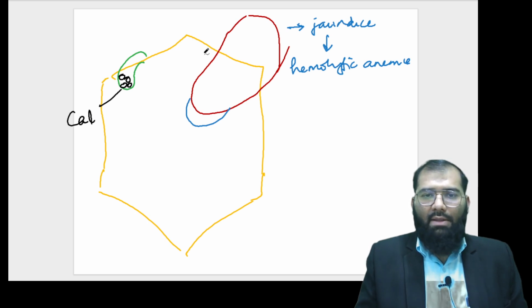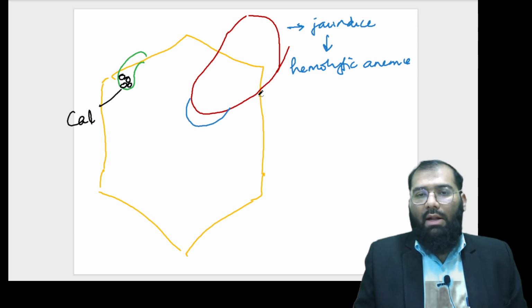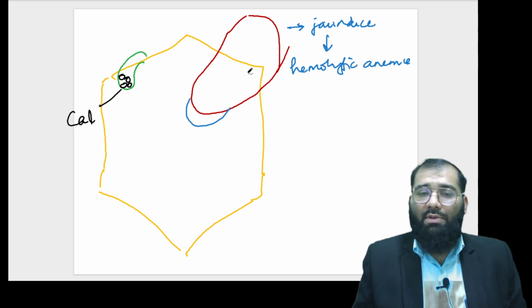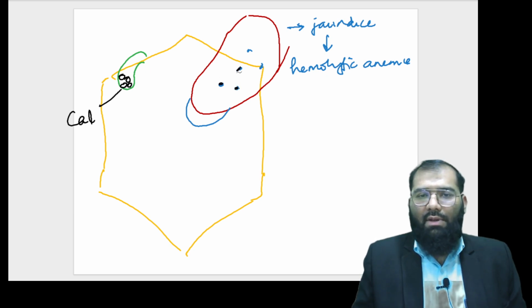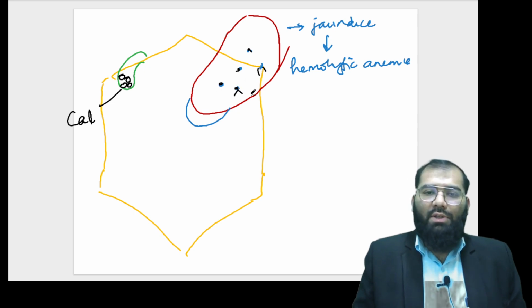Sometimes you might find that the spleen is enlarged, and let us assume that this is a patient sent by a physician who has some medical illness, and you see that there are multiple calcific foci. How do I identify calcification on ultrasound? It would show the calcification and there might be some shadowing, the posterior acoustic shadowing.